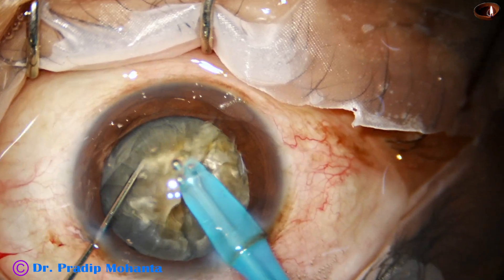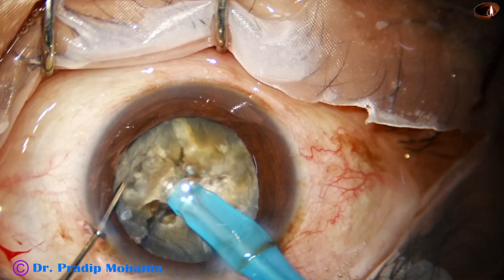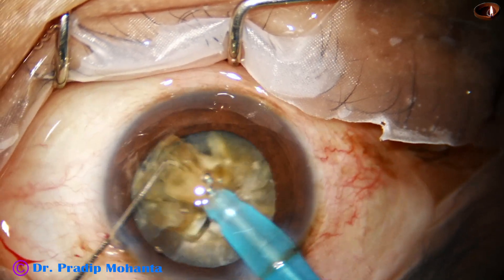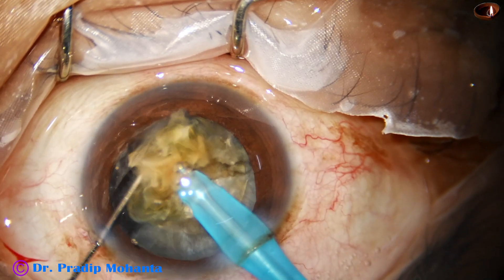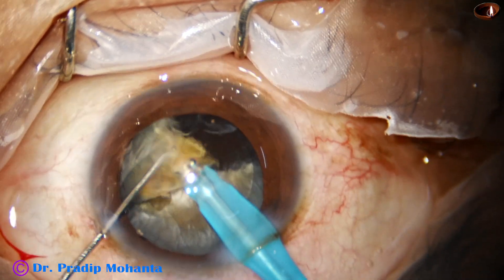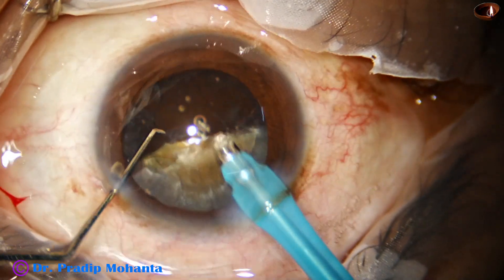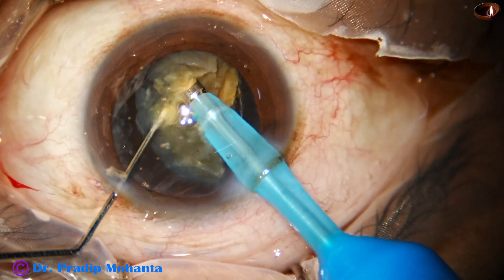This hemi-nucleus is being subdivided into three fragments. This is one fragment. The larger piece is subdivided into two smaller fragments. These three fragments are now being emulsified. From the very beginning, the ultrasonic energy used is 85%, flow rate is 48 ml per minute, and vacuum is 480 mmHg. The chamber is very stable — a rock-steady anterior chamber. This is an OACS category 3 for documentation.